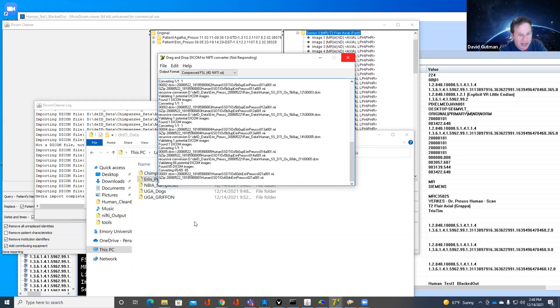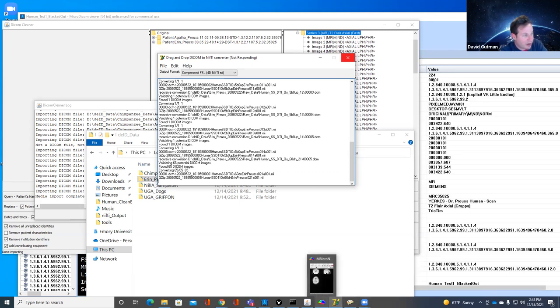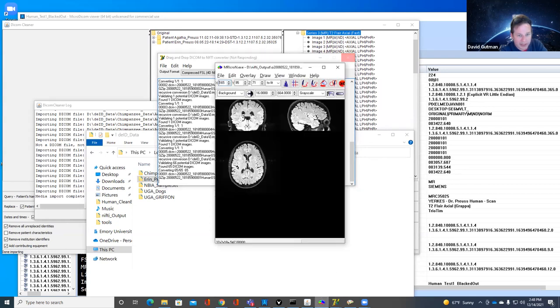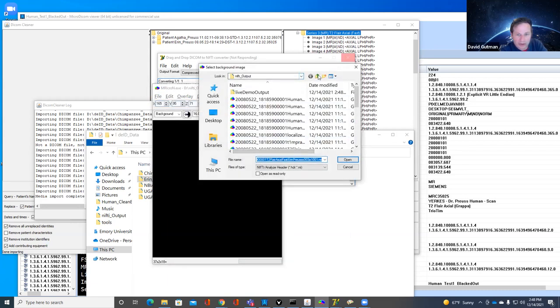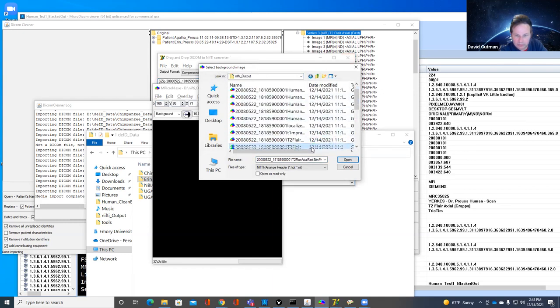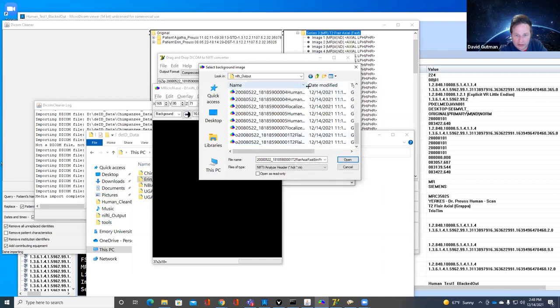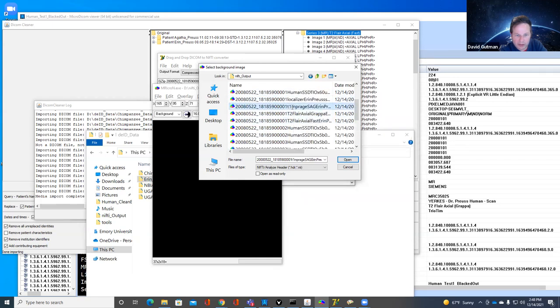The trade-off is that I've just thrown out a lot of metadata that probably a third of the researchers listening probably need to do some of their image reconstruction. However, the verification of looking for PHI is easy. I'm using MRIcron — the cousin of dcm2nii, written by the same author. I go to the NIfTI output files and open the T1 image. I am guaranteed there is no PHI other than her face.